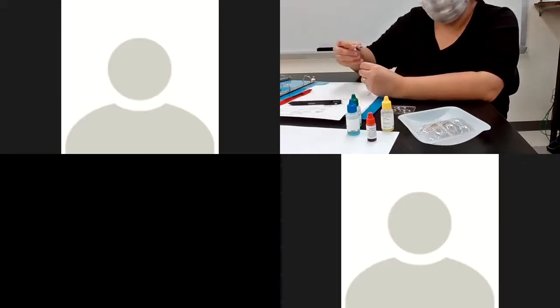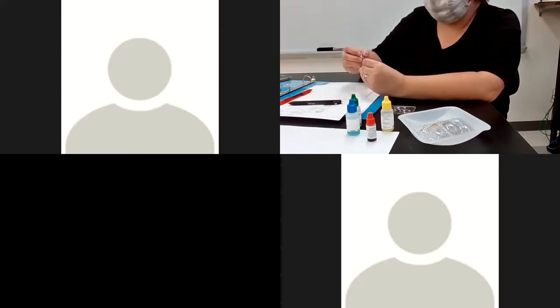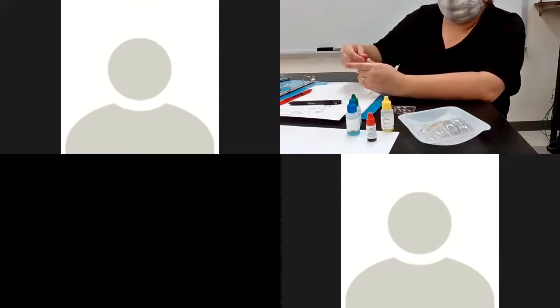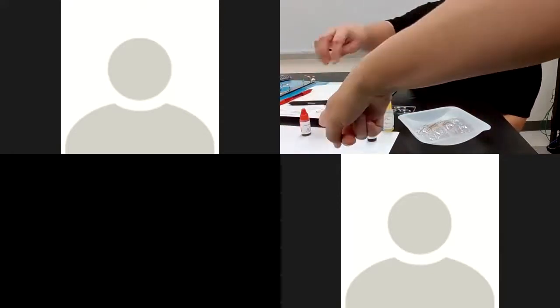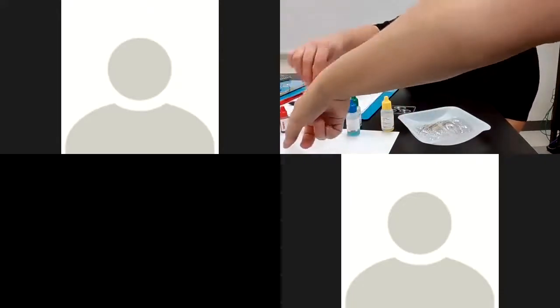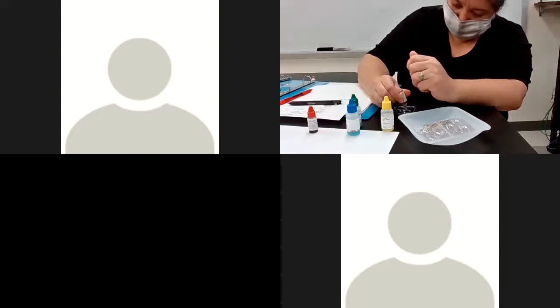You can put a little bit more. You want enough that when we add the two together, there's enough, because we got the dregs, the bottom of this has been used in 111, and we get the leftovers. So put a few drops in each well. So same blood type, same one. No, you keep using the same one. Put them in all 3 wells.